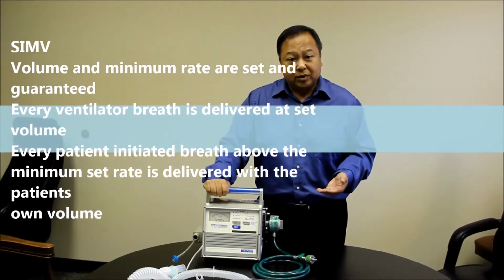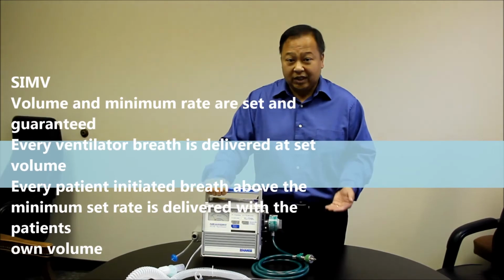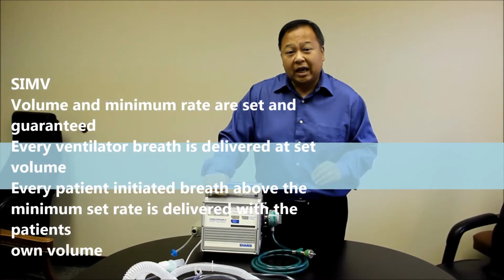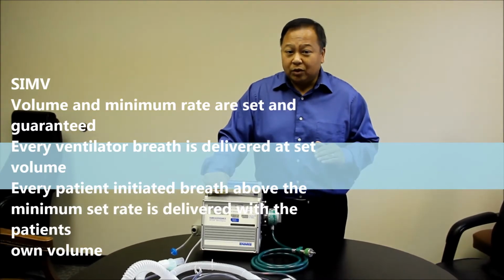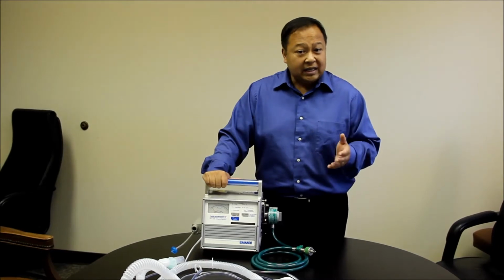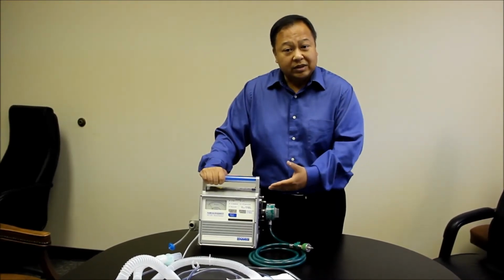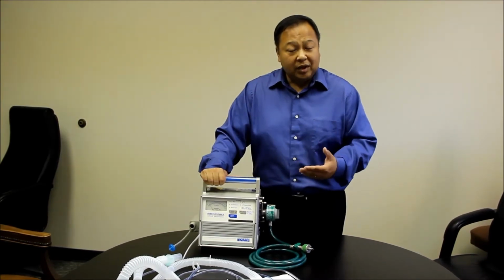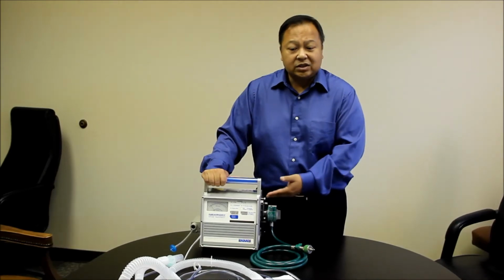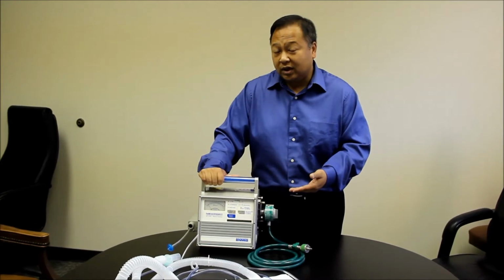The second mode that we can put a patient on is called SIMV, which stands for synchronized intermittent mandatory ventilation. It's an intermediate mode away from the assist control mode. When you're on SIMV, if the patient is not breathing, the ventilator will do its thing and breathe for the patient. But being on that mode, it will also allow a patient to breathe on their own. Say, for instance, you have a patient on a tidal volume of 400 mLs.